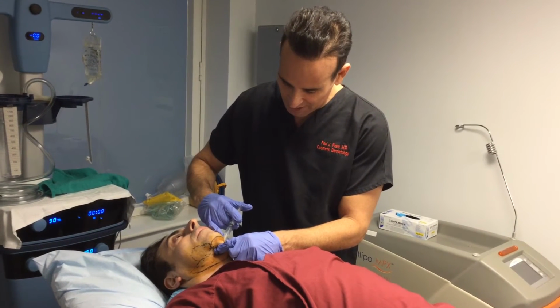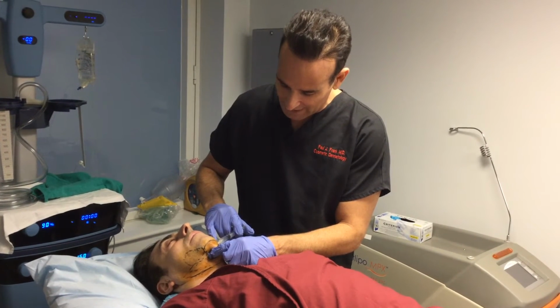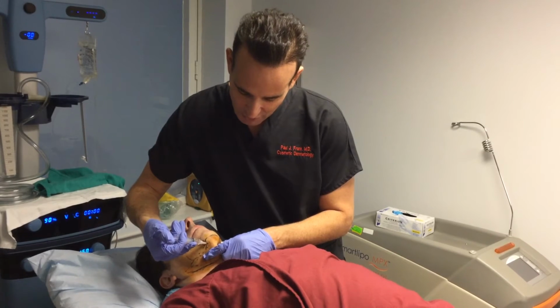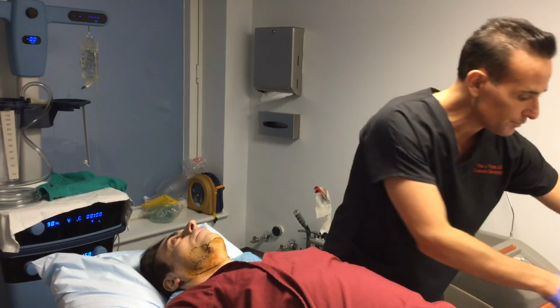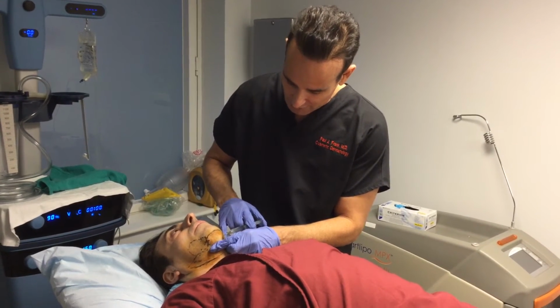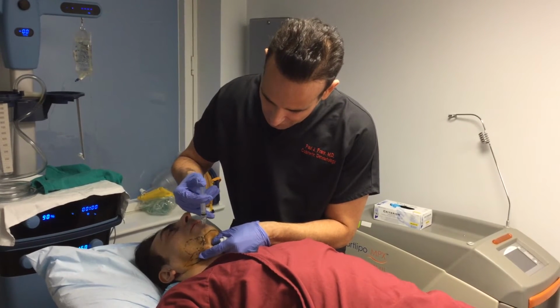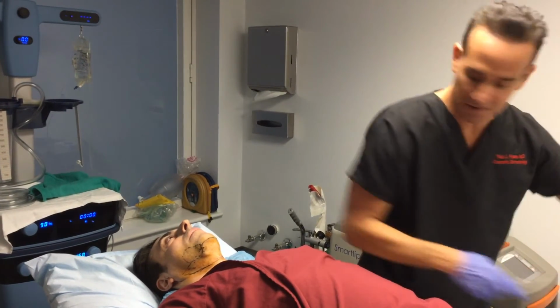But this is a very safe plane to work on. It's above the muscle. There's really no risk of getting any of the understructures, blood vessels or nerves or anything, because he's awake. If I were doing anything that would cause him significant harm, he would jump and say ouch. So once I get a little bit of anesthesia in there, I will then fill up the area a little bit more aggressively. You've got to get bigger before you get smaller here. What I'm doing is really just flushing the area with local anesthesia. He'll start to not feel anything in a second.